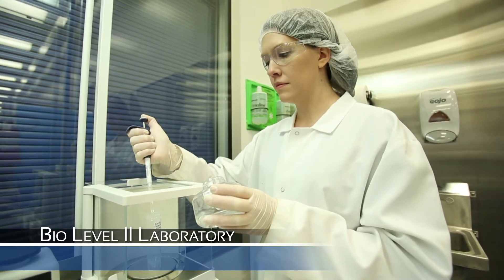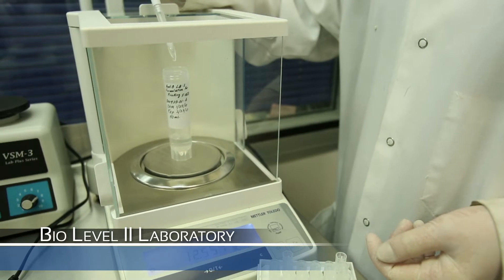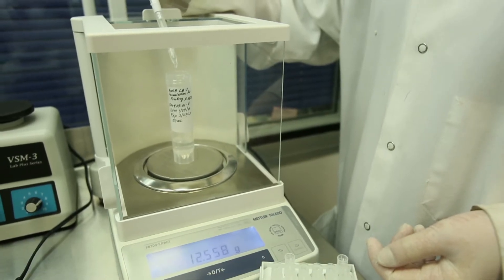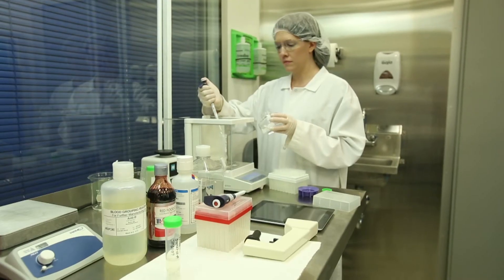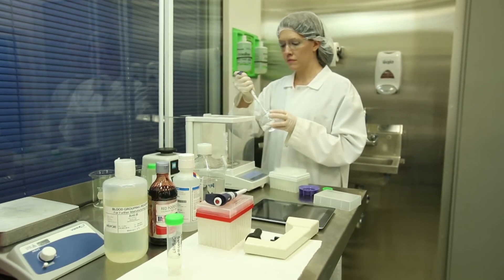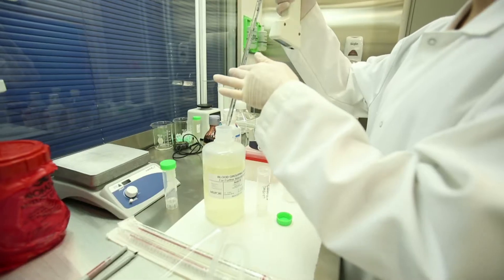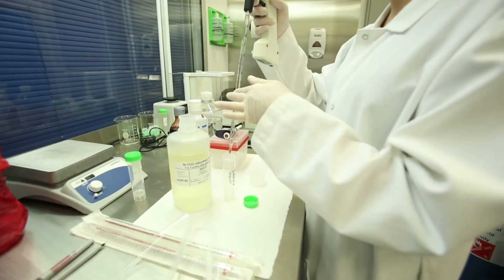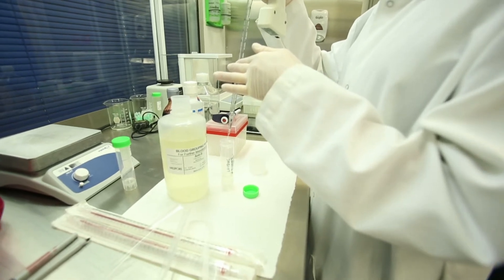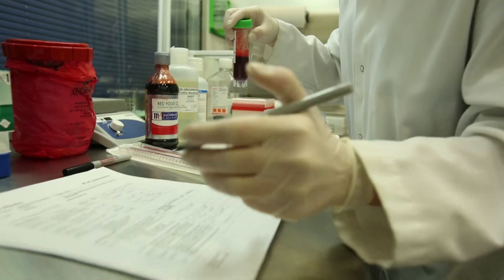Microfluidics begins in the laboratory where a series of chemical reagents are formulated, each contributing to the function of the product. We formulate three specific antibody reagents — A, B, and D, or RH. These formulations are composed of a mixture of reagents and solutions, some of which are also formulated in our laboratory.